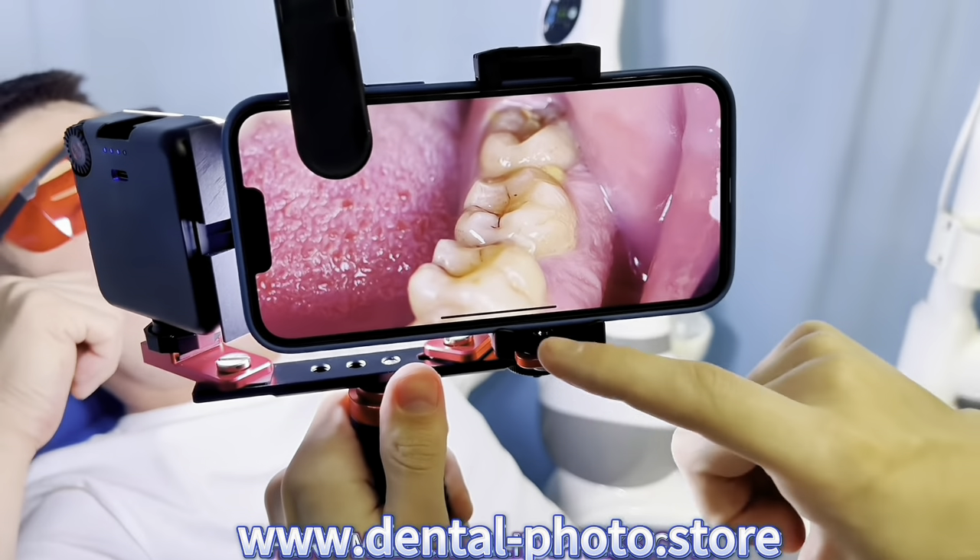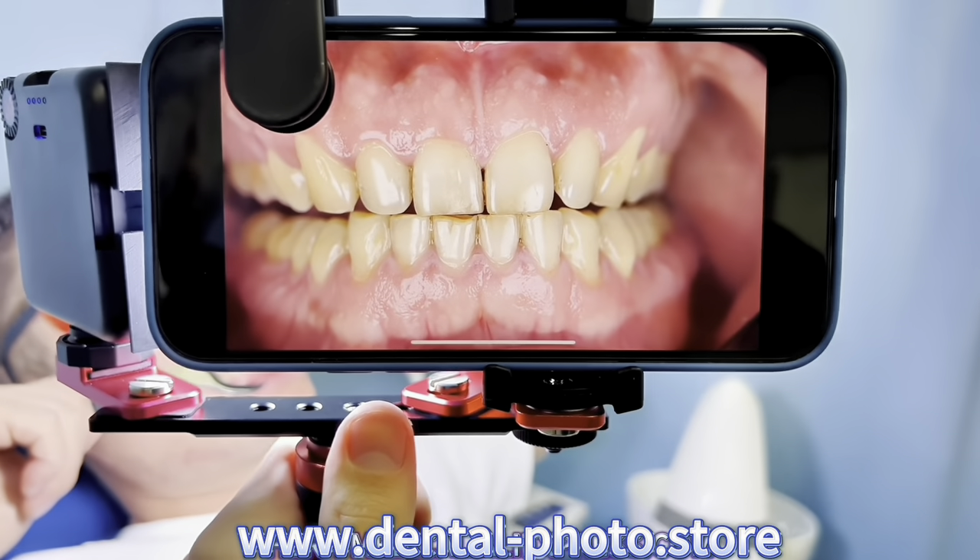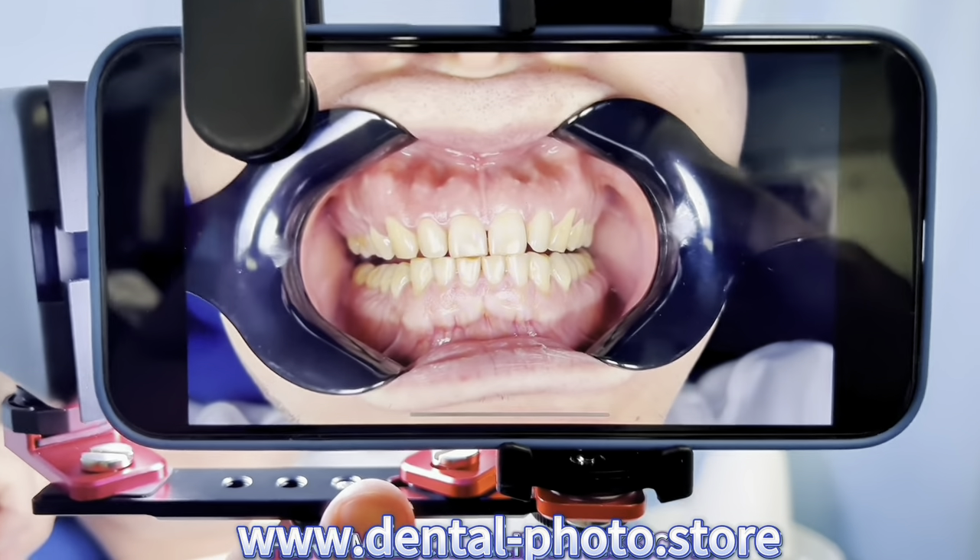Here is the photo of the molars with the 100 millimeter macro lens. Here is the front teeth with the 100 millimeter macro lens. And here is the photo without the macro lens.